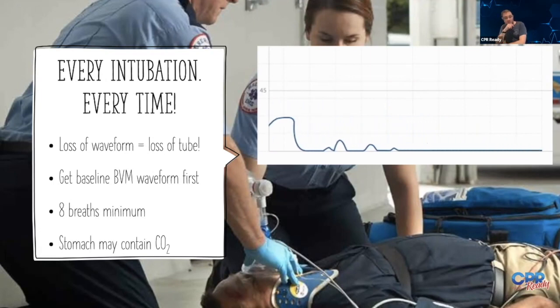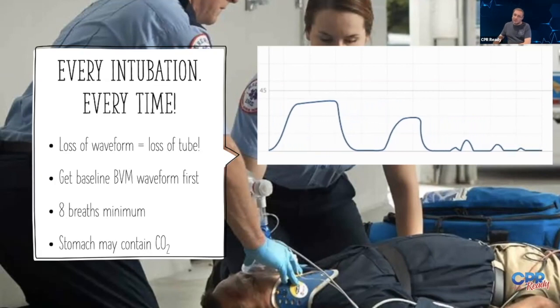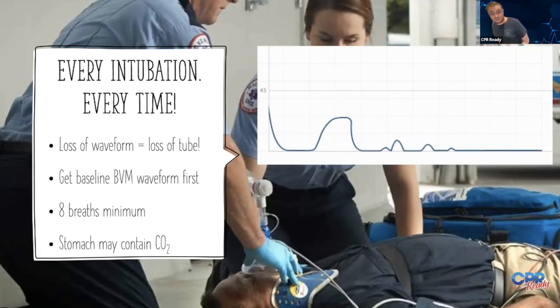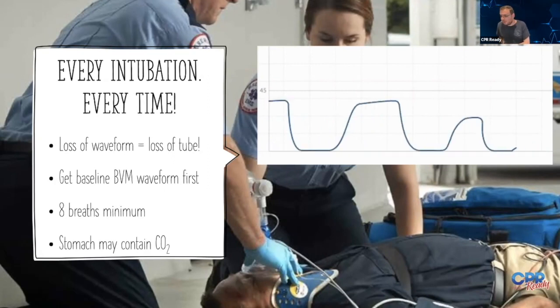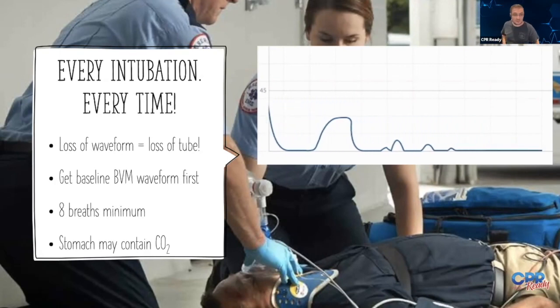Sometimes if you do have an esophageal intubation, you might get those little blips like you're seeing at the end there. So you might see little ones at first, especially if they've had a carbonated beverage. If they've had a soda before they got intubated, you may have a little bit of CO2 in the stomach. So when you first bag, and if it is in the esophagus, you might get some small kind of wannabe waveforms there, but within 8 breaths, those are going to disappear if it's from the stomach. So be sure you look at it more than just for a fraction of a second right after the tube goes in, so you make sure it stays nice and regular.